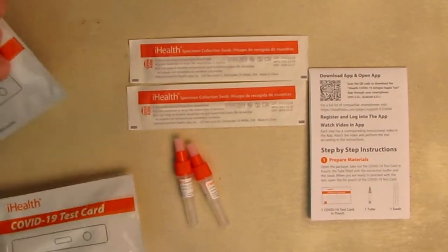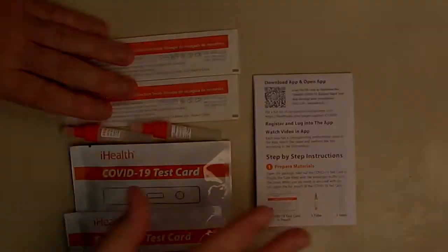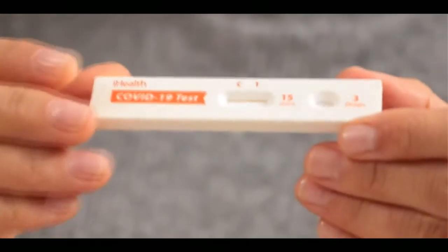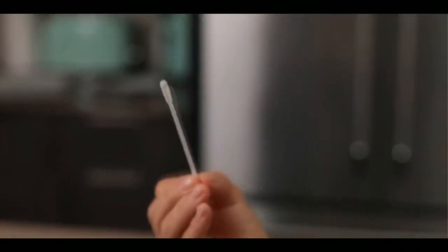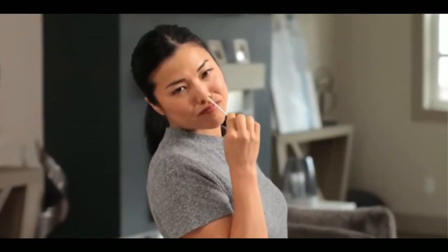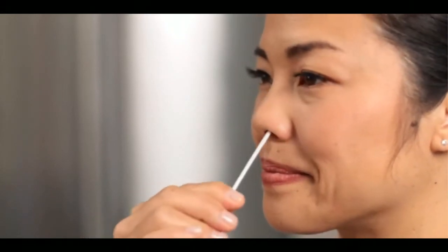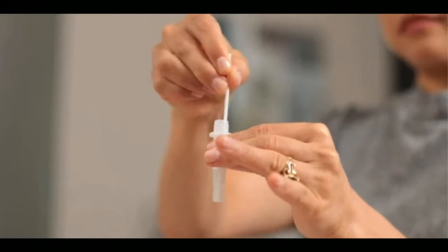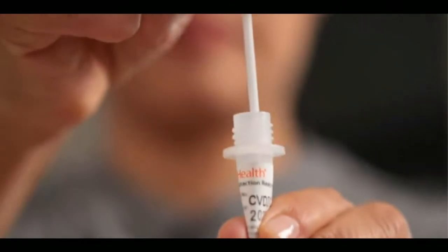Tear the foil packaging off your test card and lay the card upright so it's ready to receive your test solution. Open the handle end of the swab package and pull out the swab — be sure not to touch the swab end with your fingers or bring it into contact with any potentially germy surfaces. Swab as if you're cleaning the inside of your nose; this is not a matter of simply twisting the swab in place. When finished, swab your other nostril the same way. Insert the swab all the way into the solution and twist it back and forth at least 15 times.